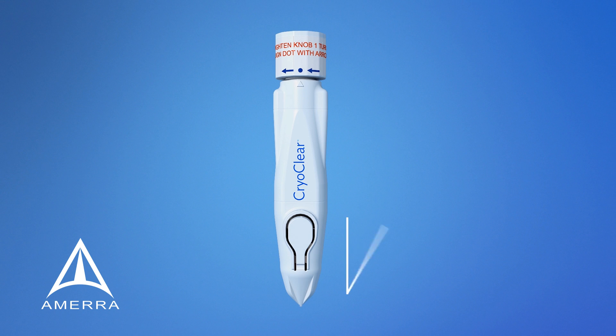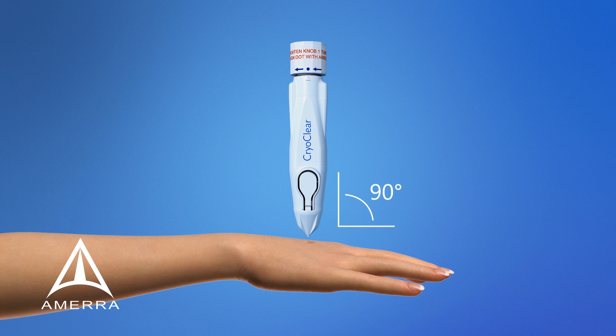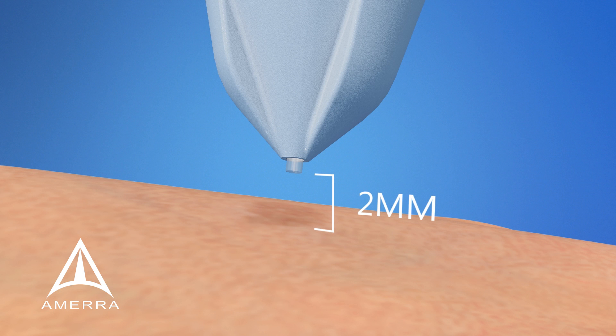Position your client to allow the CryoClear pen to be used at a 90-degree angle to allow for the proper flow of gas onto the treatment site. Next, position the tip of the pen about 2 millimeters away from the treatment site. The pen should never come in contact with the client's skin.